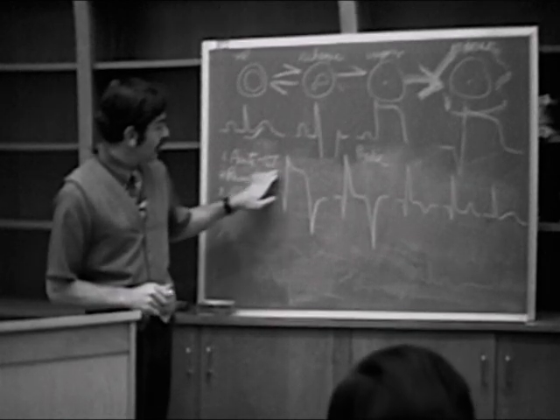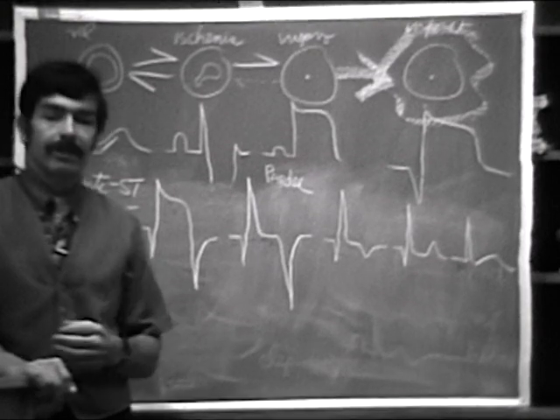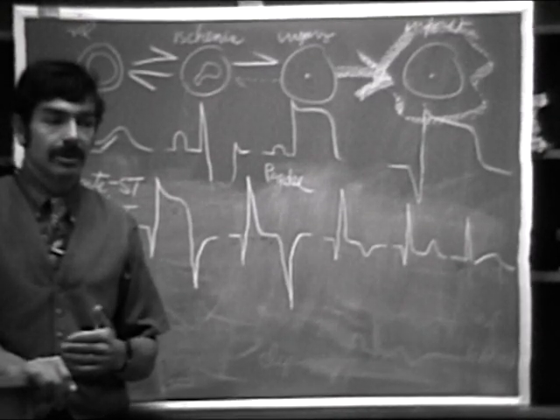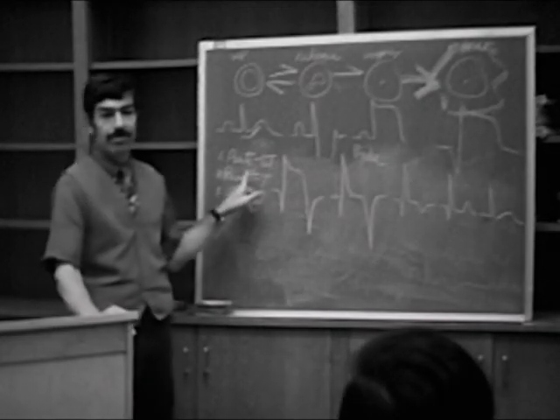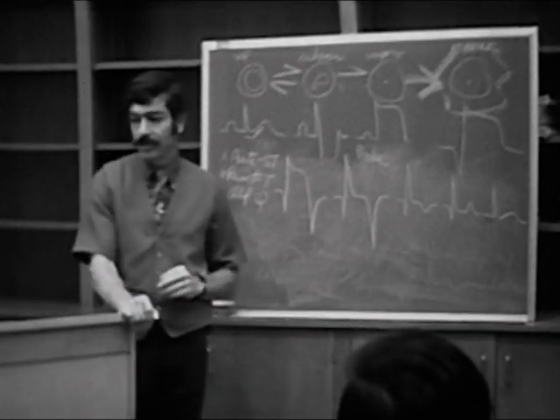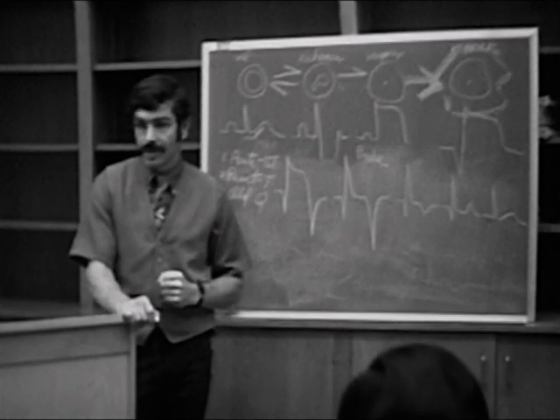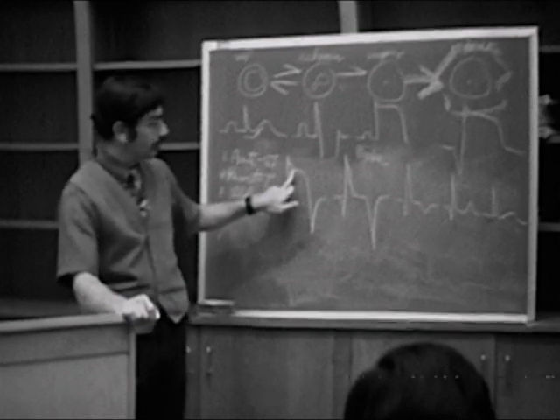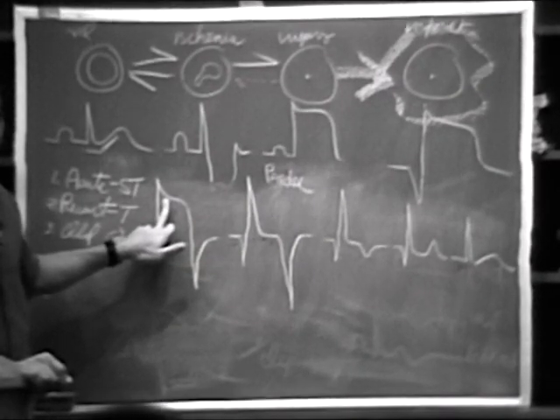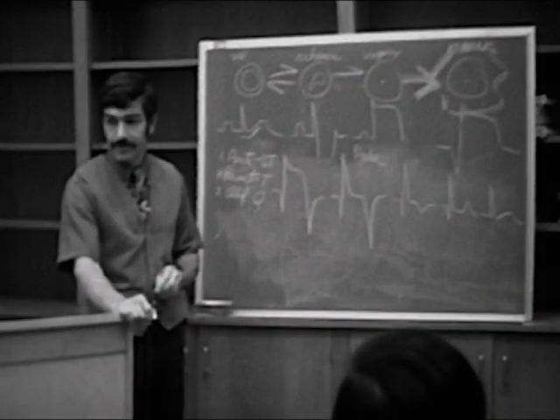Okay, so the ST segment generally stays elevated 3 to 5 days, and you'll notice also that this coincides fairly well with the time that we usually keep patients in the intensive care unit. Because when their ST segments are elevated, this seems to be associated with electrical instability, arrhythmias, things like that. Right? And therefore, we generally keep a patient in the unit for 4 to 5 days. But if his ST segment remains elevated, we may watch him a few more days. Right?